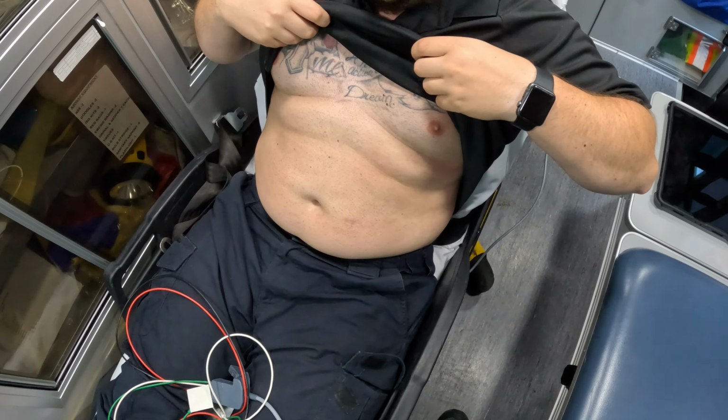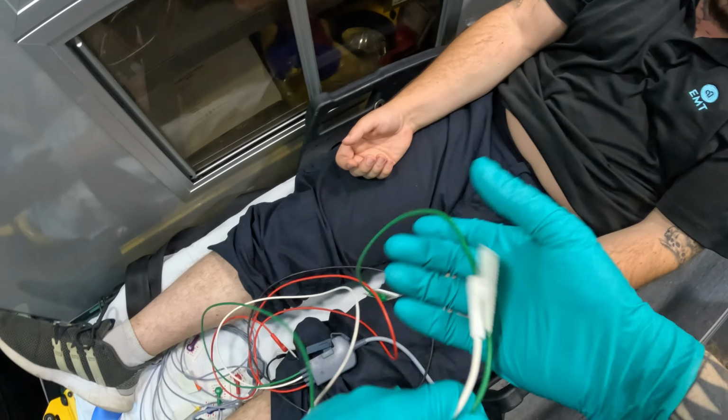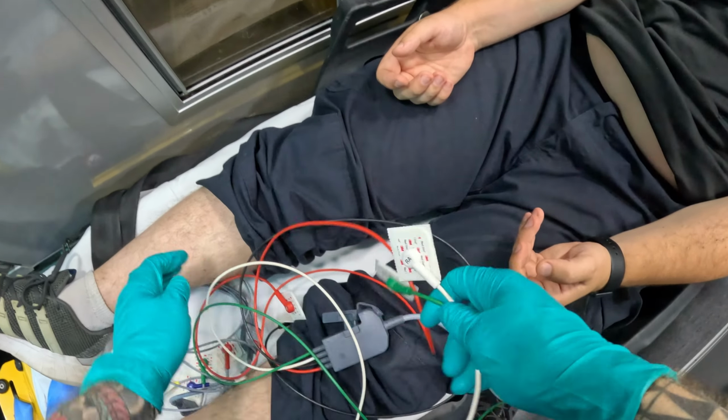Like this. I'm going to first put the limb leads on, right? Actually, put your hands down for a bit, and then you're going to lift up your shirt. So this is my mnemonic. You could use whatever mnemonic you want. Usually that's how I teach it, because I feel it's the easiest to remember. So you take your limb leads, right? And you see for LifePak 15 and maybe some other monitors, they're color coded. So I have four colors: white, black, red, and green.